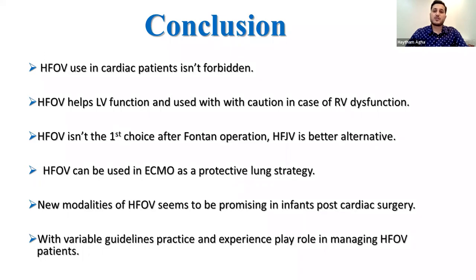So this is the conclusion of our lecture today: that high frequency oscillatory ventilation in cardiac ICU is not forbidden, can be used, and should be used with caution and in the right way. High frequency oscillatory ventilation helps LV function. It decreases the afterload and decreases the oxygen demand of the LV, and should be used with caution in case of RV dysfunction, because overdistension will impair the afterload of the RV.